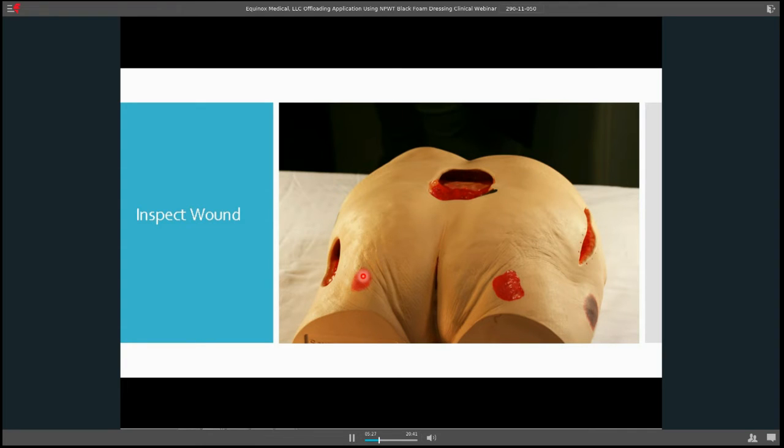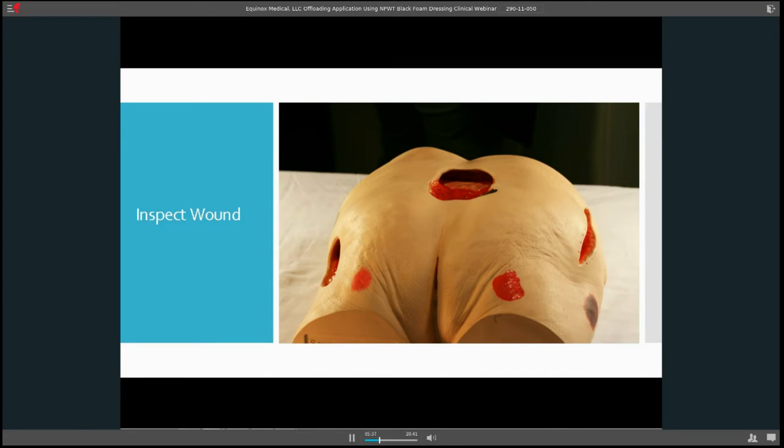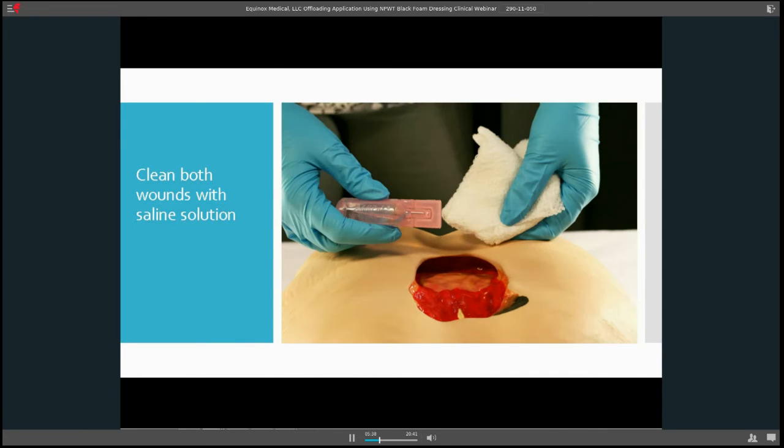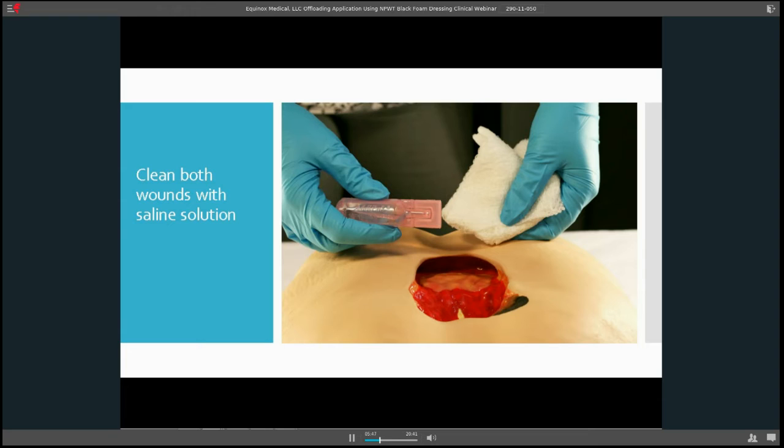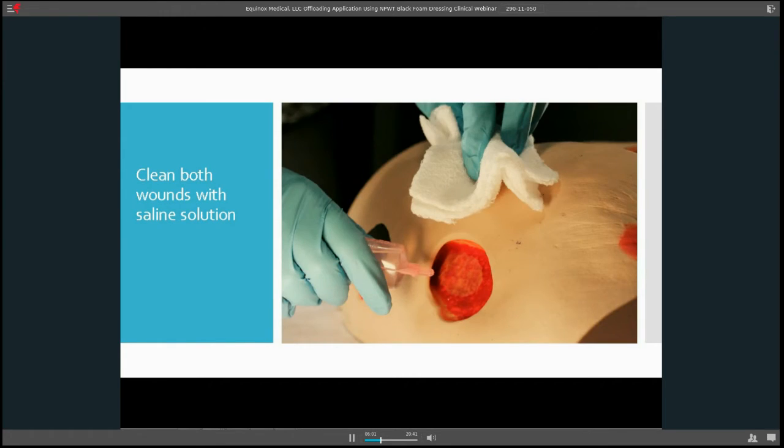They want to do, per their facility protocol, some type of wound prep, getting the wound ready for healing. They want to definitely efficiently irrigate that wound to remove any foam fragments or debris. Here we're offloading. We're going to clean the wound. If we had two wounds, we'd be cleaning both wounds. But here we're mostly going to talk about offloading, which would be to move the dome to an area that would not be laid on by the patient.